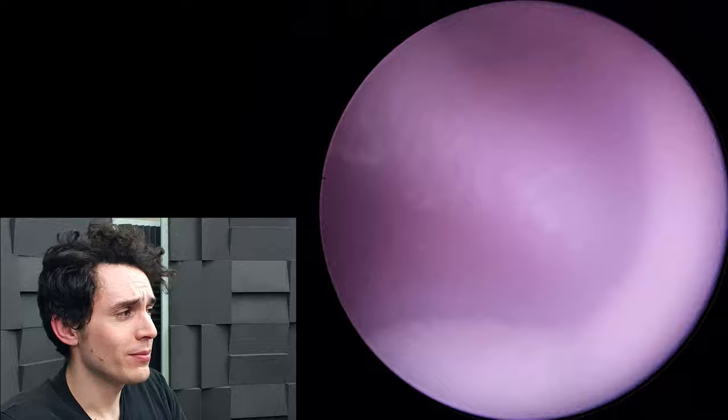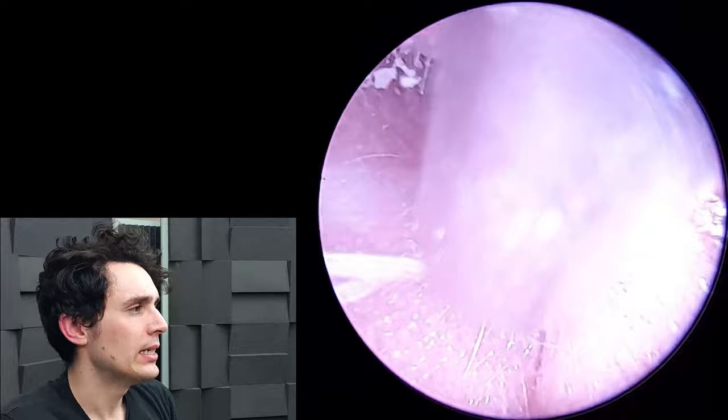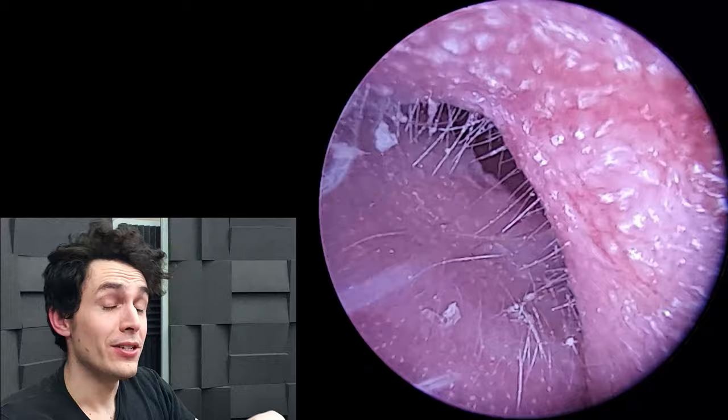There are some fissures in the skin which the patient reported had been bleeding and was quite uncomfortable. Unfortunately one of these fissures did actually start bleeding during the procedure, but nothing too intense — just a tiny little bit.